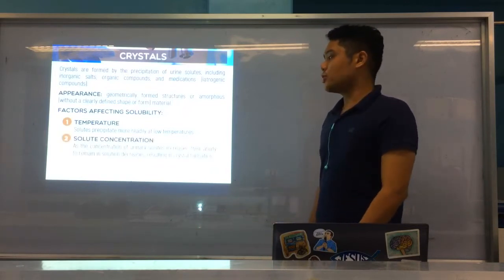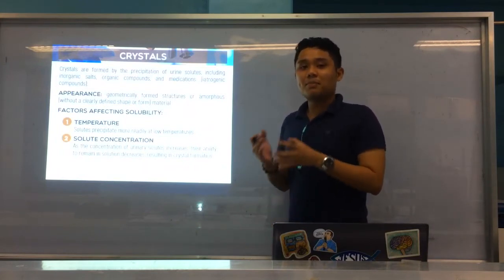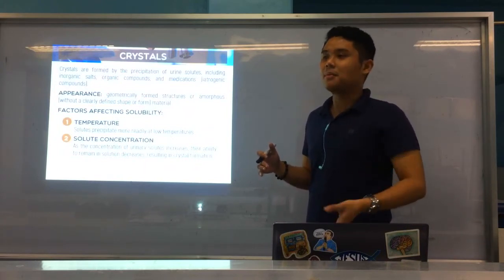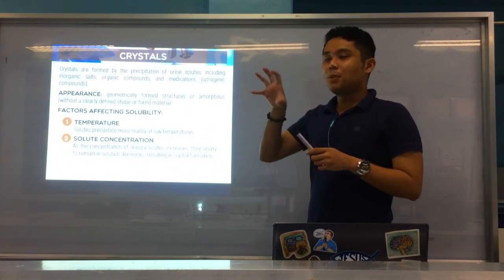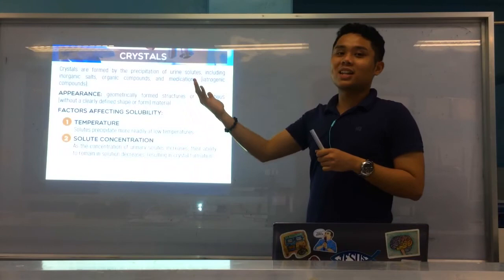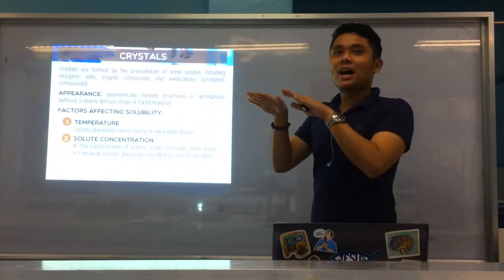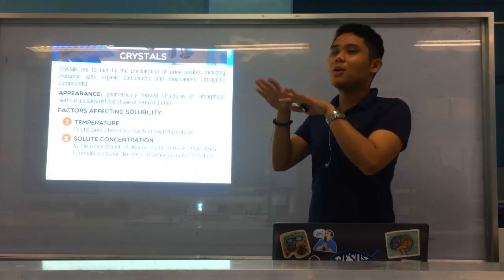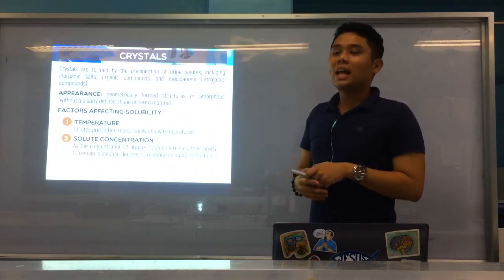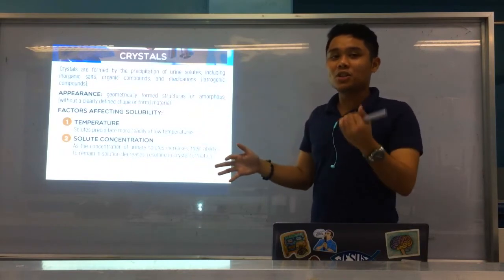Okay. And for solute concentration, of course, if your urinary solutes increase, they tend to be precipitated, right? Remember the principle of saturation in your general chemistry? If a solution reaches a threshold, the concentration of solutes where they are equal in their, what do you call this, I forgot the term, basically equal in their solubility. But if more than that, it becomes a saturated solution. What happens is those substances precipitate, right? And if more than that, it becomes supersaturated.